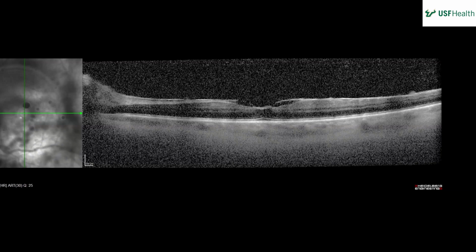Yeah, just like a raised spot attached to the ILM, but I don't know what it would be. Just like a little deposit. Given all that junk in the vitreous, maybe it's a clump of cells or some sort of deposit that's sitting on the surface of the retina.